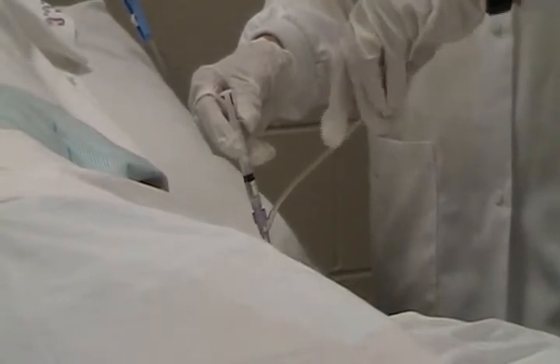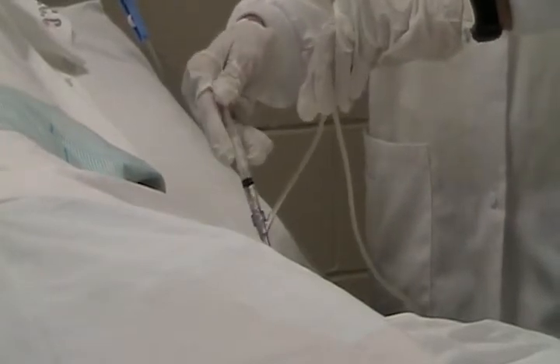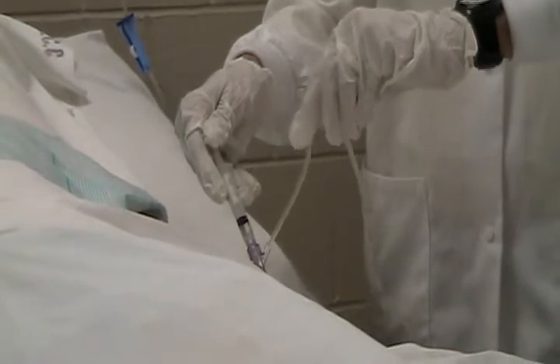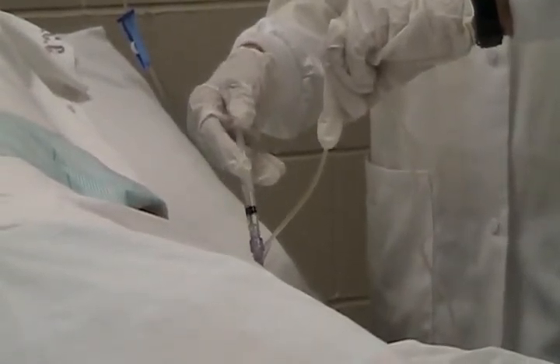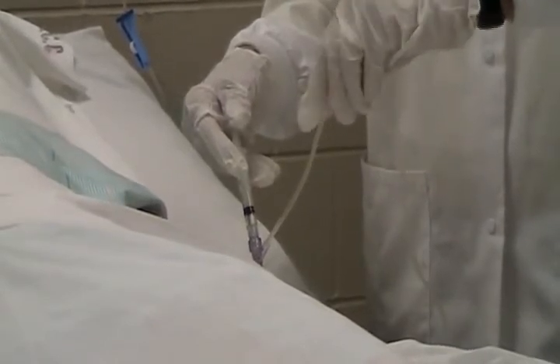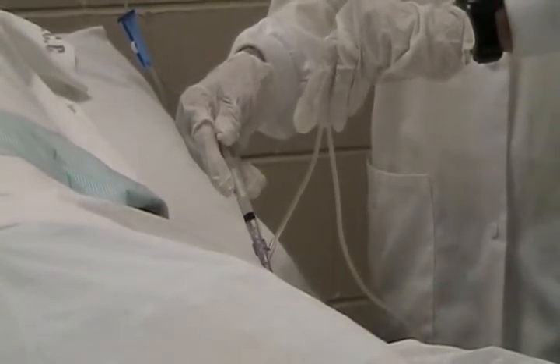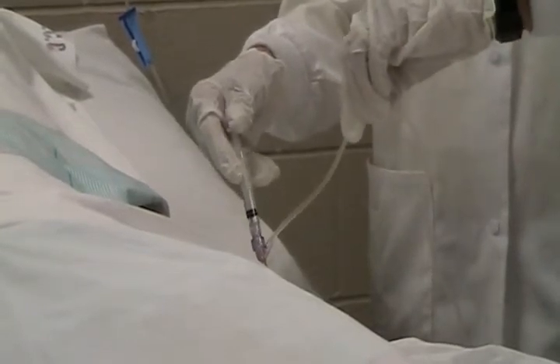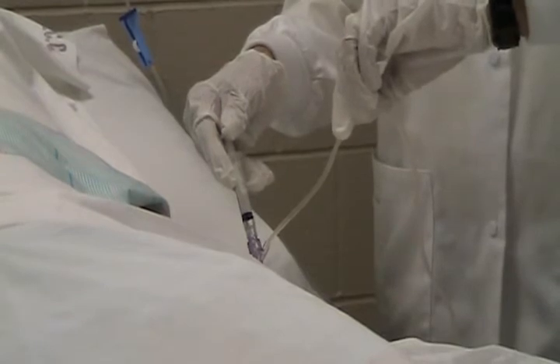Once the first 15 seconds have passed, I'm going to pinch the tubing again, administer approximately 0.3 of the medication, and release the tubing. So I'm pinching, injecting, and releasing. Okay, I'm going to do that again over the next 15-second period of time. Pinch, inject, and release. Wait for the remaining of the 15 seconds.